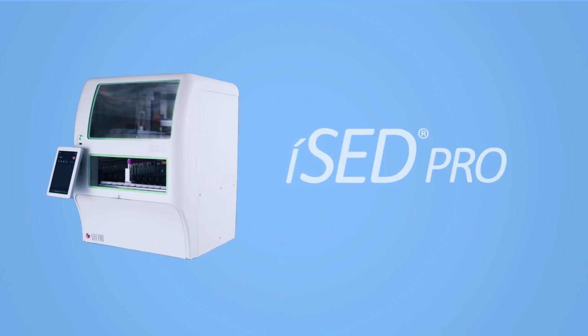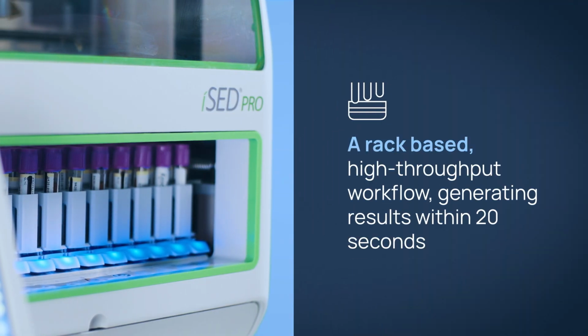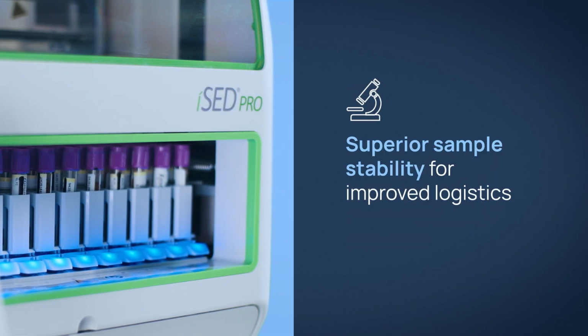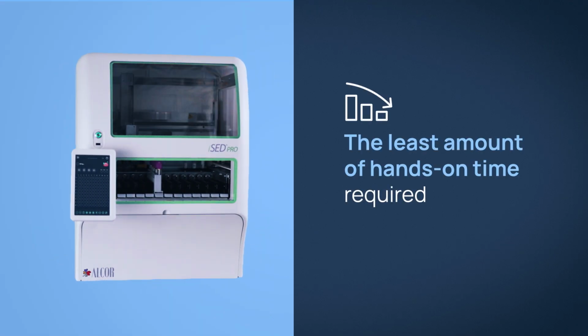iSED PRO, the most efficient, high-volume ESR solution designed for today's busy labs, transforming SED rate testing with a rack-based high-throughput workflow, generating results within 20 seconds, superior sample stability for improved logistics, automated QC and maintenance procedures, the least amount of hands-on time required.